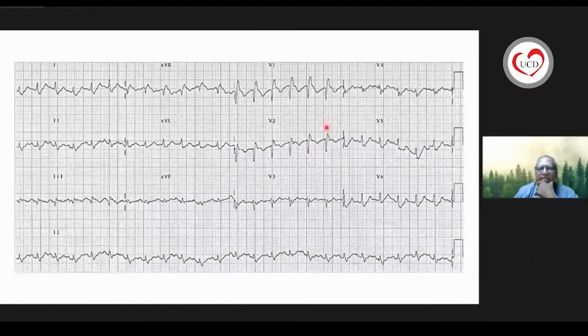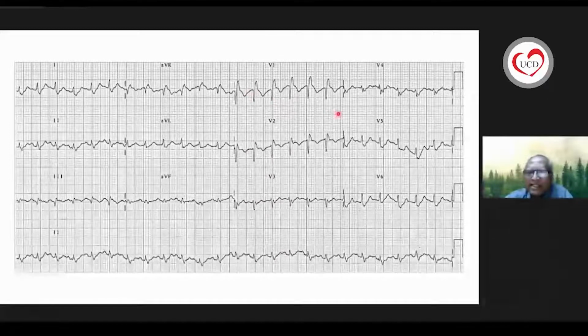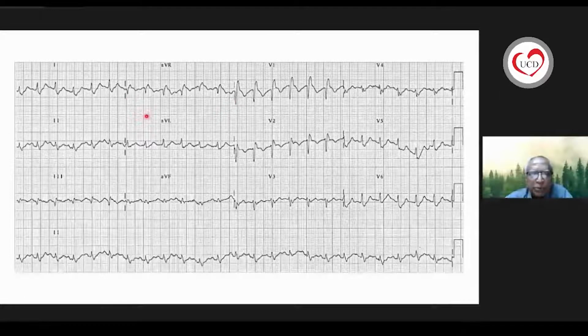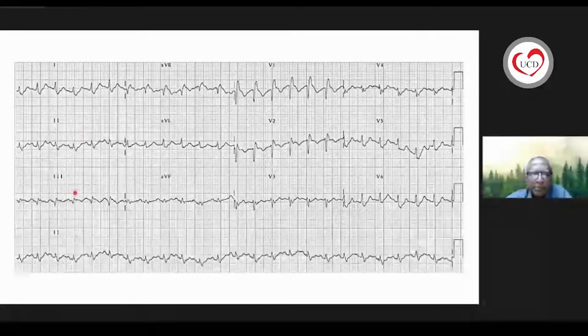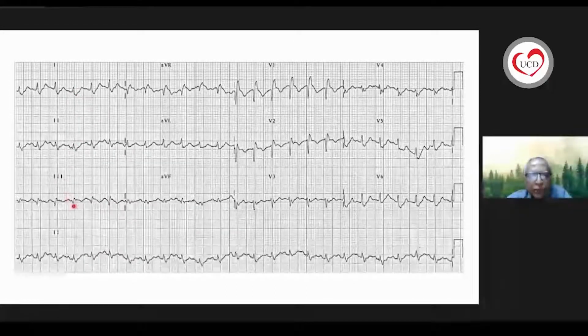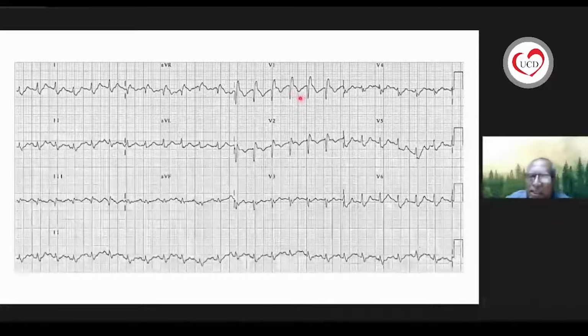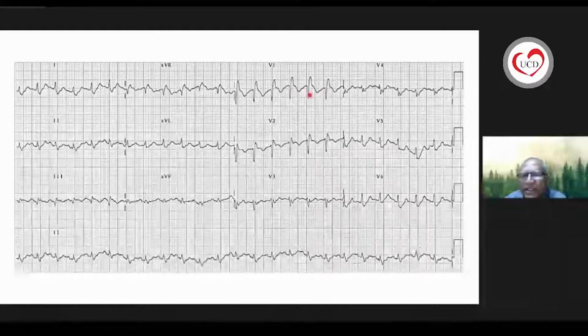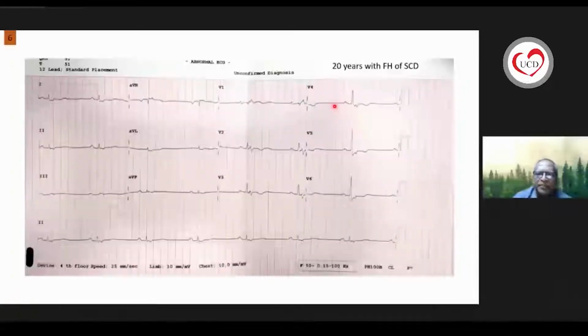The second is when you see a patient with syncope and he comes with a sinus tachycardia and he has a right bundle branch block, one of the causes which presents as syncope and right bundle branch block is an acute pulmonary embolism, which presents typically with an S1, Q3, T3 and a sinus tachycardia. You falsely see a small transient AV block and start working up the patient for a pacemaker. You may miss the underlying diagnosis in these patients.